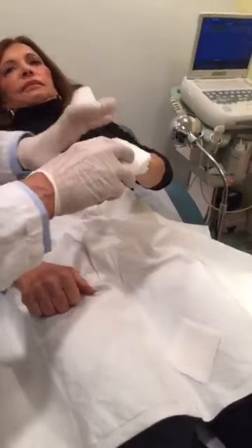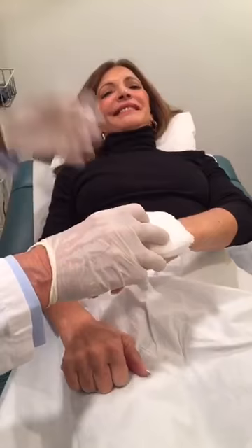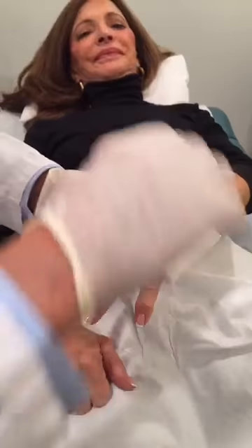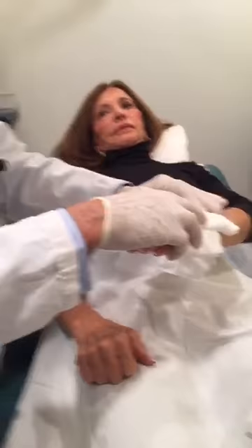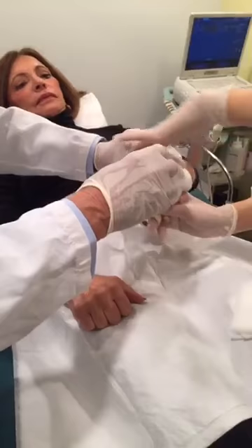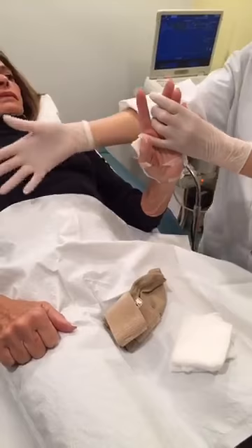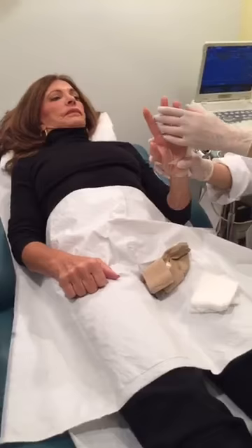Now we'll put the cream. How are you doing, Camille? How's the pain? No pain. Just a little pinch. Normally for sclerotherapy on the legs, the legs are much more sensitive. We use the cold machine and some mechanical stimulation to make sure you don't feel any pain. In the hands it's not necessary, because the hands usually are much less sensitive.